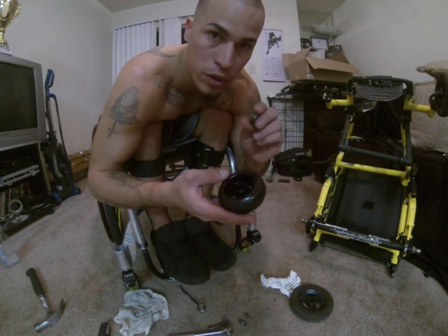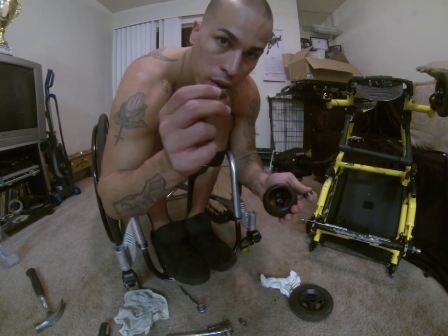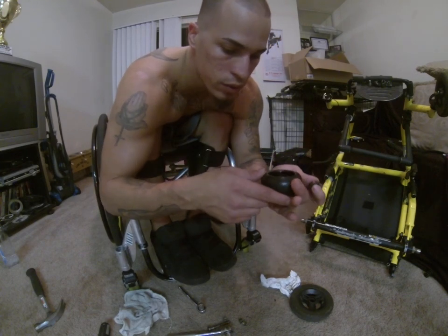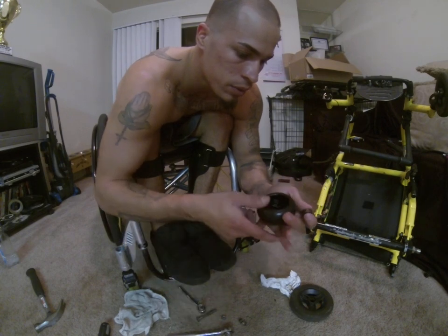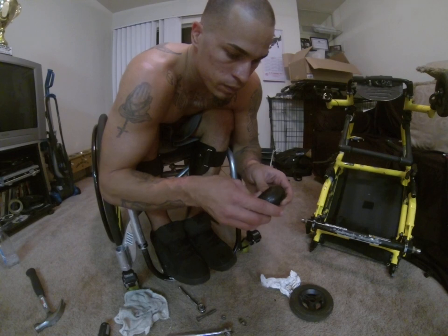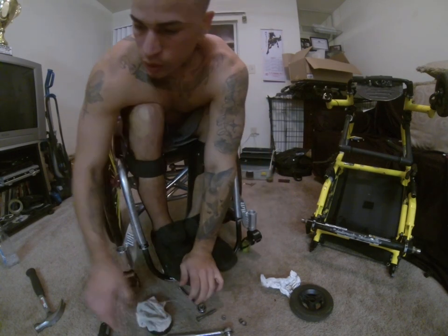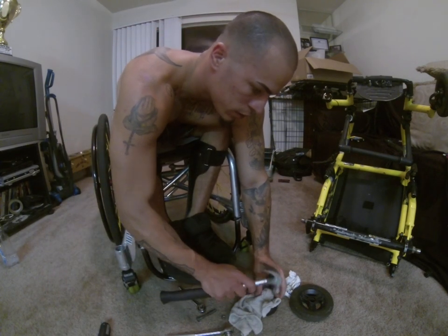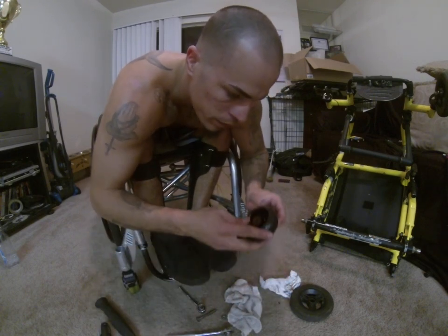And then before you put the other one in, you gotta put the middle part in there. So you drop it in there. Make sure it's going right. That way this bolt can go right through the middle. So put it in there, and then you stick this one right in there. It's a little hard, so what I'm going to do is hammer it down a little bit. Just gotta do it softly. Usually not that hard, but this one's like a tight fit.